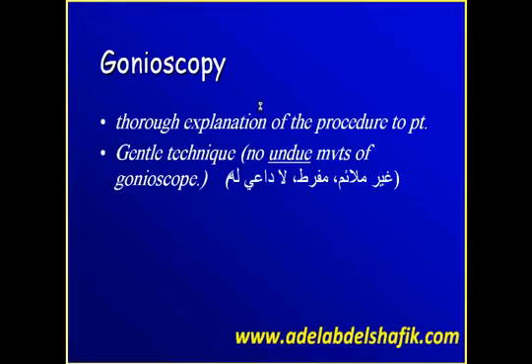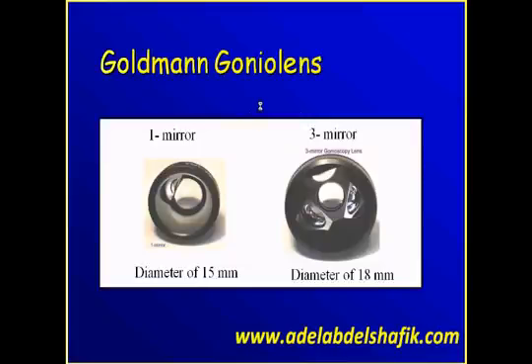On doing gonioscopy, we need to explain to the patient what we are going to do, and then we need to use gentle maneuvers when we are rotating the gonioscope, because if we do it roughly, it will be quite painful. We have different gonioscopes.